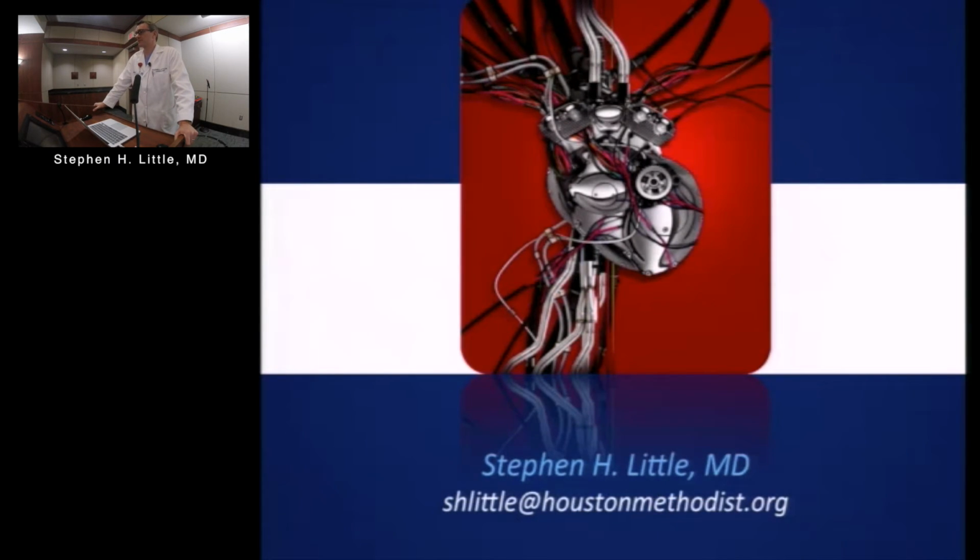The variable is a transseptal puncture. That can be very hard because sometimes it's easy, but if you get an enormous left atrium in a small person, then all of the cardiac anatomy is oriented in a very bizarre way. And although by echo I can see it, I find myself trying to convince Dr. Barker to push the needle. Because on fluoro, he's seeing this needle going somewhere where there shouldn't be a heart. And I'm like, look, it's there. It's on X-plane. I see it tenting exactly where it should be in 2 views. Trust me. And he's going, I don't know, Steve, look at this thing. It's going way back here. So sometimes the transseptal takes longer than you would want. We spent an hour just trying to do a transseptal.